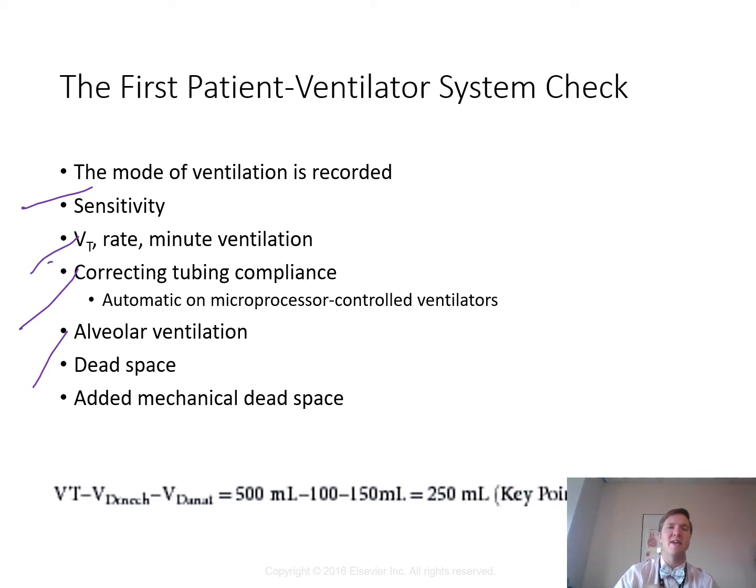So during mechanical ventilation, we take the number of breaths counted over 1 minute, and then we're going to look at their anatomical or mechanical dead space. So tidal volume minus anatomical minus added dead space, and that's what you're seeing here. Tidal volume minus anatomical, right? Do you guys see this? Tidal volume minus anatomical minus added mechanical dead space. So that's what we're looking at here, and so we're taking those out.